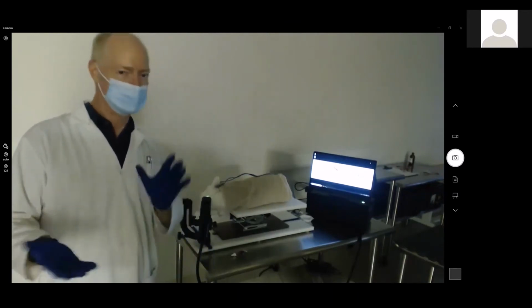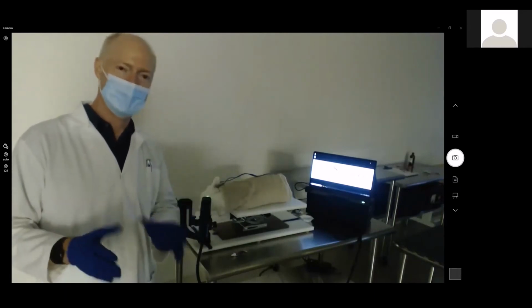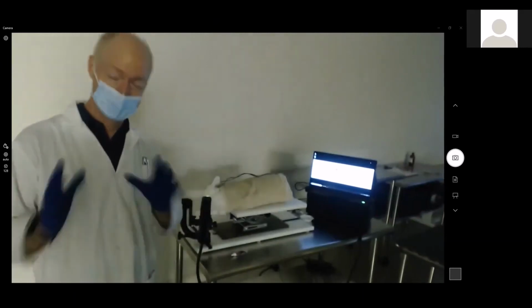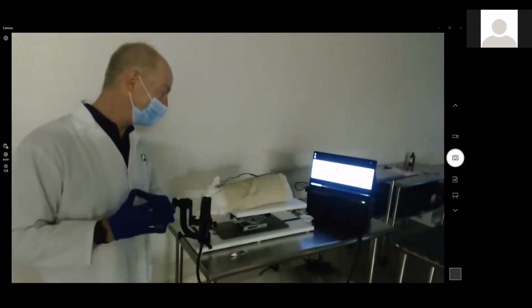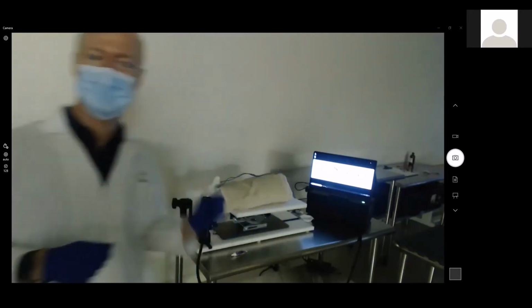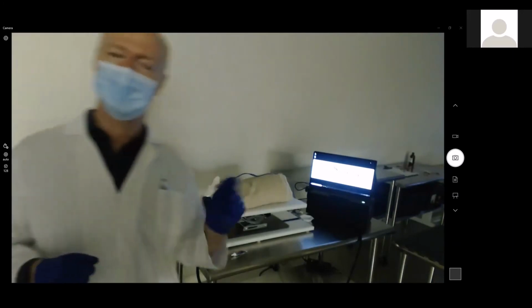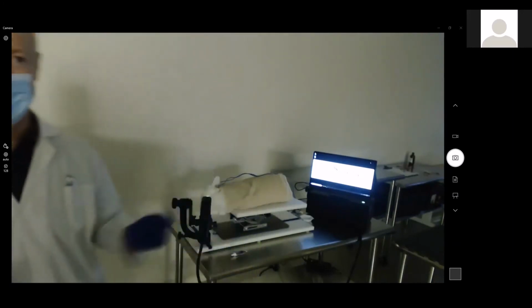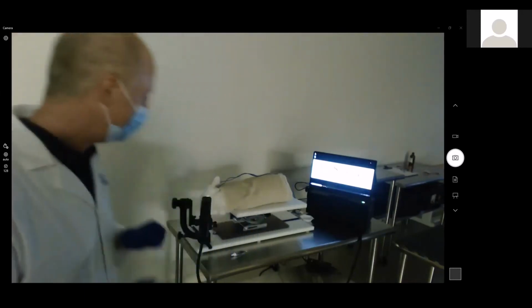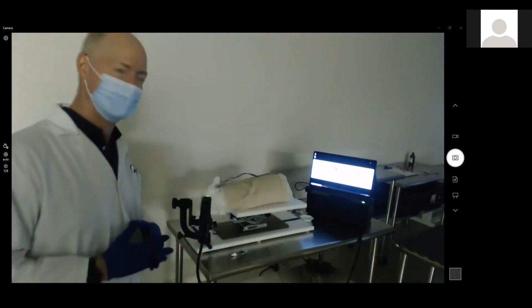It's like any animal: the more compliant they are, the easier it is to collect data. Working with a puppy could be a bit challenging, so wish me luck in that regard. We're going to make a real quick change here. And then lastly, I'm going to do a fundus image using a different technology, just a little fundus camera, so that people get a quick appreciation for what that can do as well. That's pretty much it, and then we'll conclude this wet lab after that.